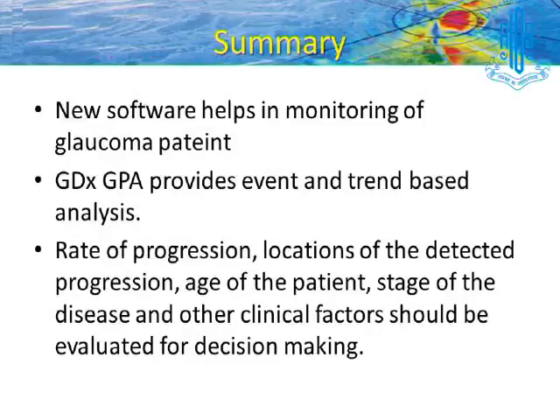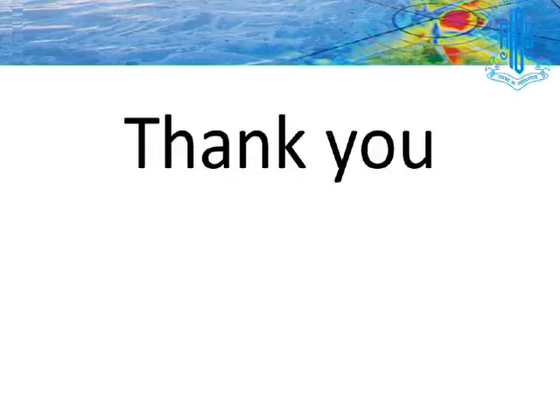So to summarize, the new software helps in monitoring of glaucoma patients. GDX GPA provides event as well as trend-based analysis. Rate of progression, location of detected progression, age of patient, stage of disease, and other clinical factors should always be evaluated before taking any decision. Don't take a decision only based on the imaging technique.